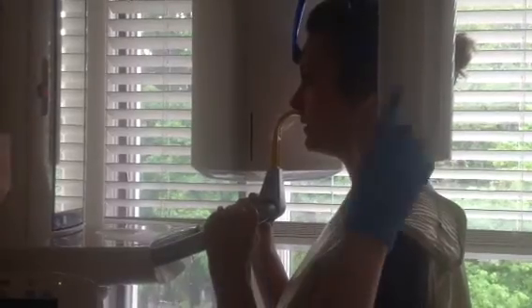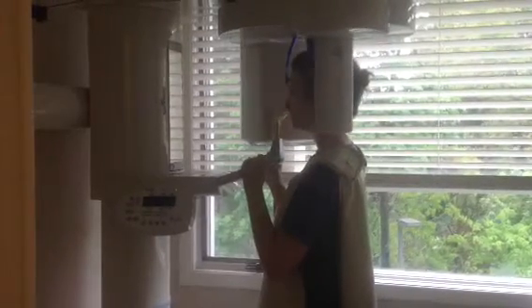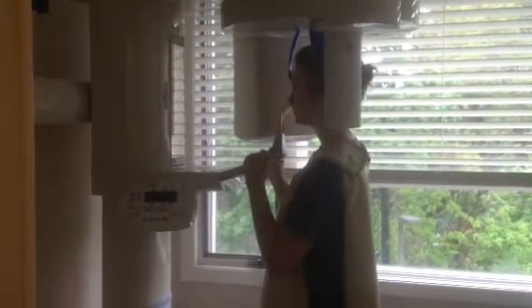Stay biting. Just going to swing around your head. The patient has to stay perfectly still, stay biting, and not move during our x-ray.